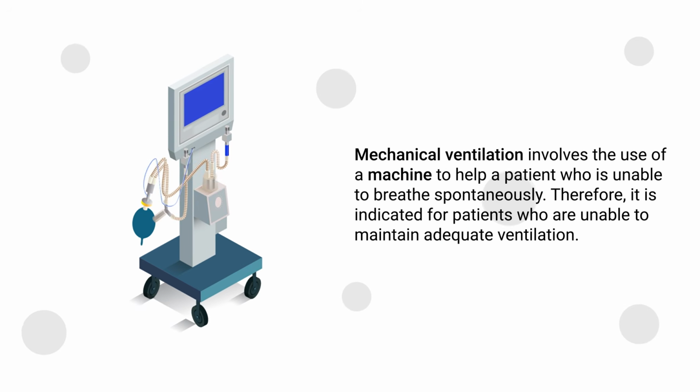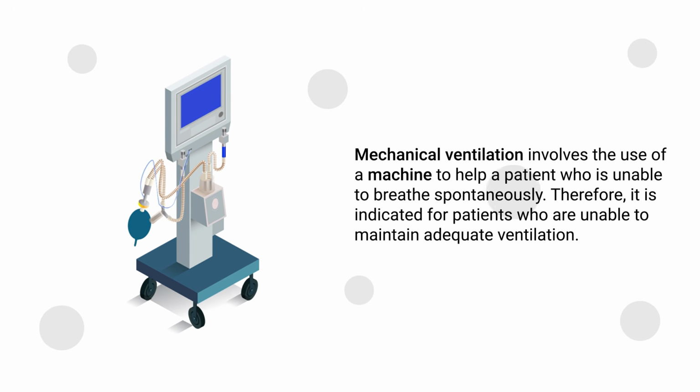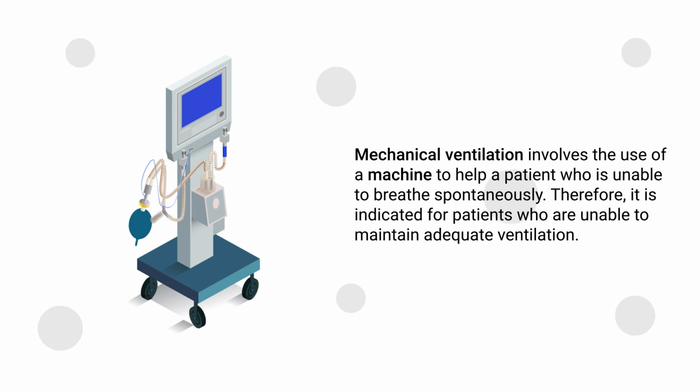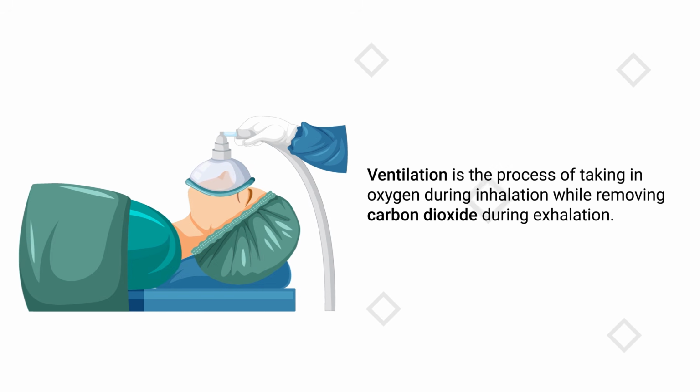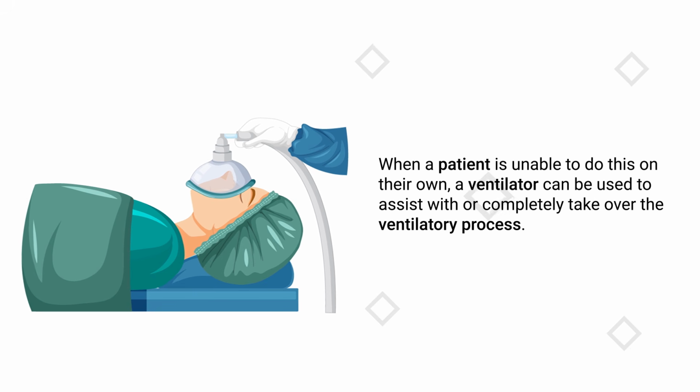As previously mentioned, mechanical ventilation involves the use of a machine to help a patient who is unable to breathe spontaneously. Therefore, it is indicated for patients who are unable to maintain adequate ventilation. Ventilation is the process of taking in oxygen during inhalation while removing carbon dioxide during exhalation. When a patient is unable to do this on their own, a ventilator can be used to assist with or completely take over the ventilatory process.